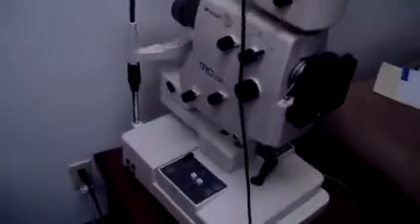Hey, it's Keith from DCSP Medical. Today we're looking at a TRC-50IA digital camera. We just brought this in. It has two batteries with it and it has the battery charger with it.